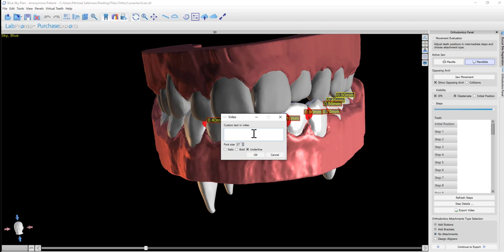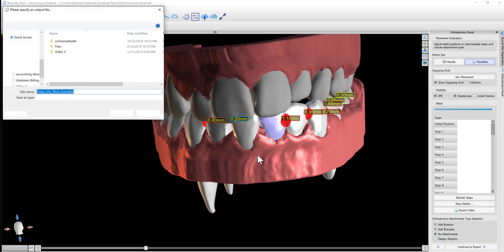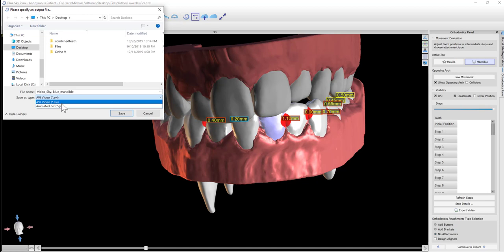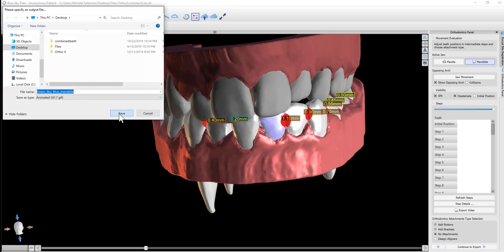And if you do want custom text, you could put in whatever text. You could set the size bold italic underline and click OK. You then have the option of choosing if you want to export it as an AVI file, which is a video file, or if you want to export it as a GIF. You could choose the data type you want, where you're going to save it on your computer, and then click the save button.